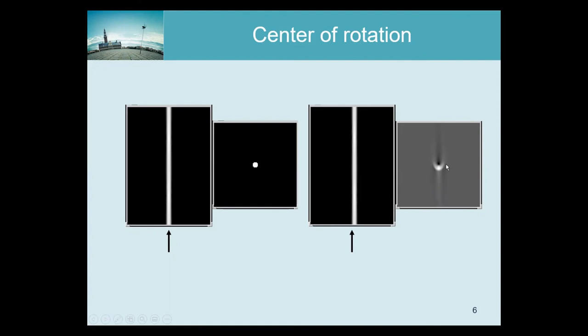And so that means if you do, like in brain scanning, 180 degrees acquisitions, your image will look blurrier. But if you don't look closely, you will not see. Which again emphasizes the need to do at least every now and then a scan to check if your scanner is still all right, because some effects can distort your image, but it's not so obvious that you would immediately see it if you take a quick look at the reconstruction after the acquisition of the scan.